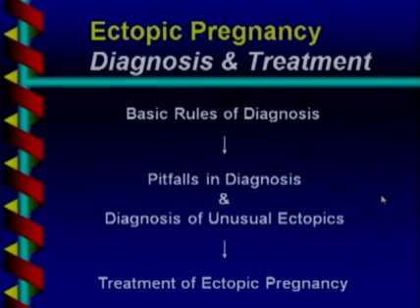The overview of the talk that I'll be giving, I'll be covering both diagnosis and treatment. I'll start out my talk with some basic rules of diagnosis of ectopic pregnancy. I'll move on from there to some pitfalls in diagnosis as well as diagnosis of unusual ectopic pregnancies. And then I'll move on briefly at the end of my talk to discuss ultrasound-guided treatment of ectopic pregnancy.